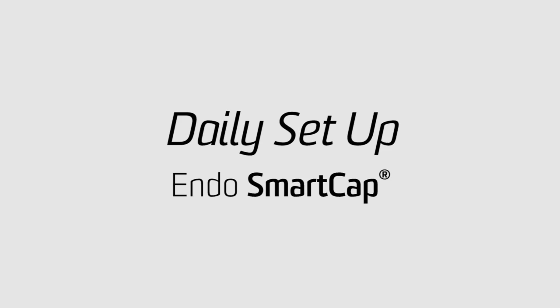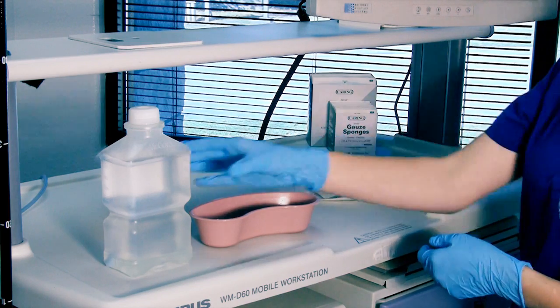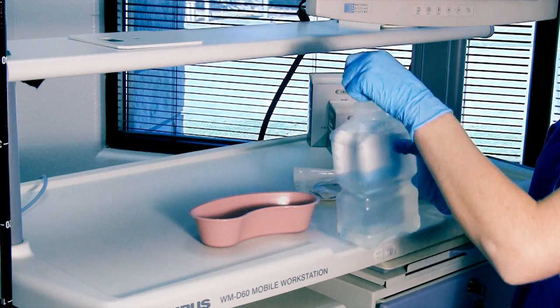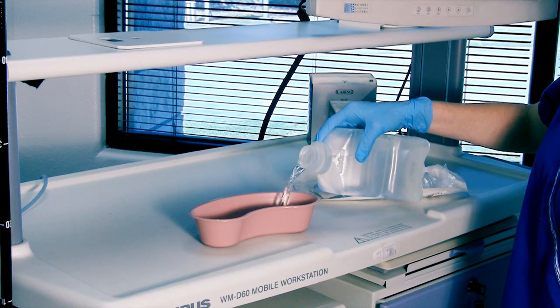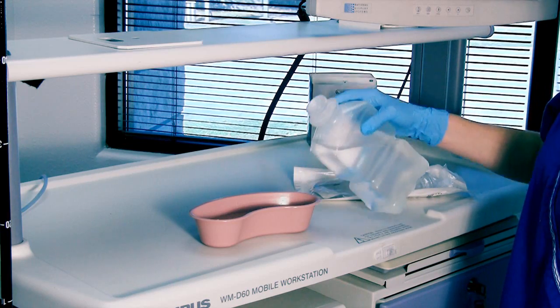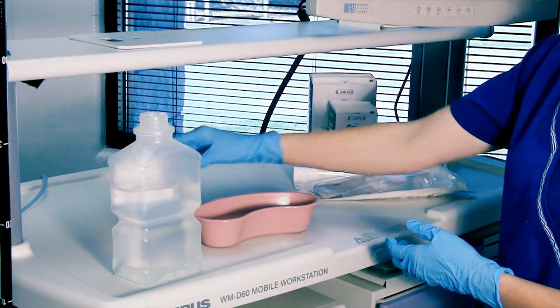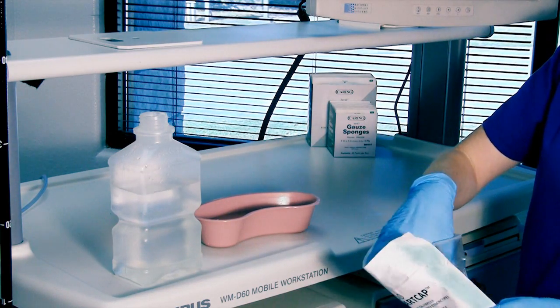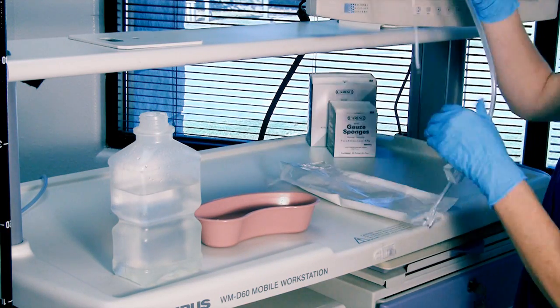The daily setup for an Endo Smart Cap is relatively simple. To start, you will need one Smart Cap in its sealed pouch and an unopened bottle of sterile water. After you have your supplies, open the sterile water bottle. Next, pour out a small amount of sterile water into a basin. This accomplishes two things: you need to create a small pocket in the top of the water bottle for the processor to be able to create enough air pressure, and it gives you a basin of water to test your scope's functionality before starting the procedure.